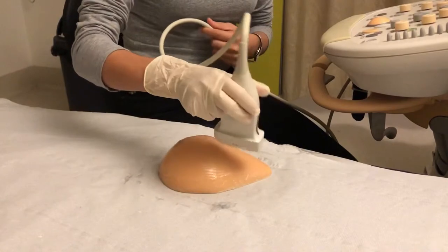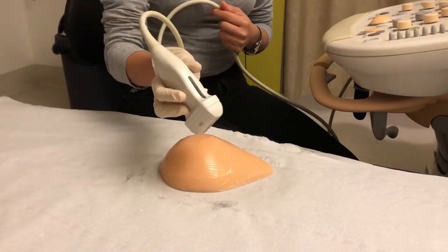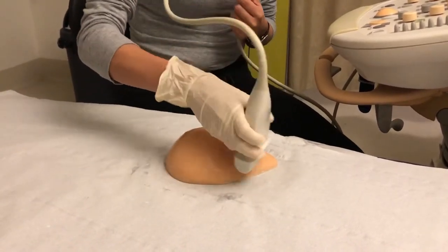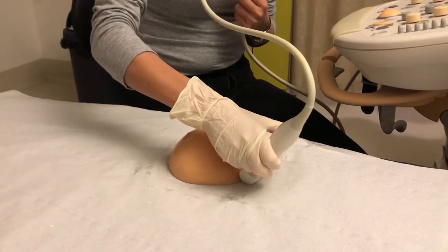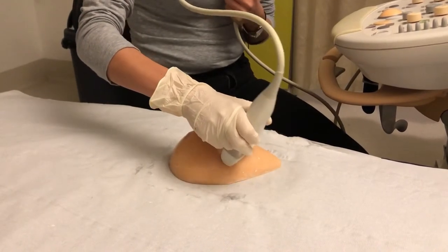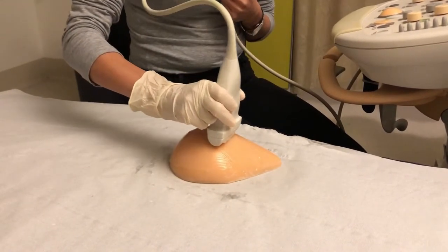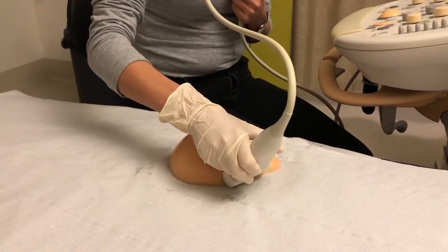Next is the anti-radial survey technique with the probe marker facing towards the skin, starting again in the 12 o'clock position, going from the outer edge of the breast to the nipple and back out.